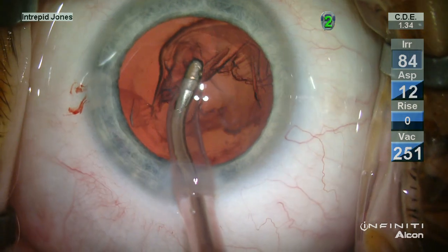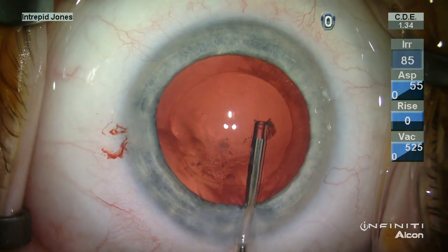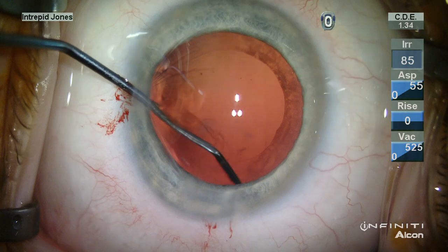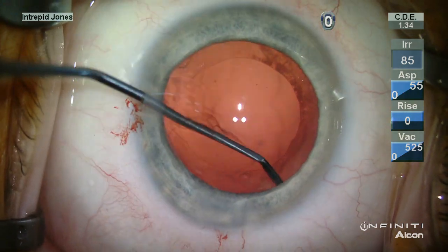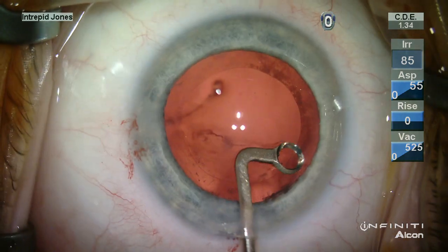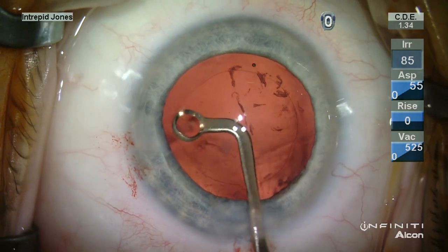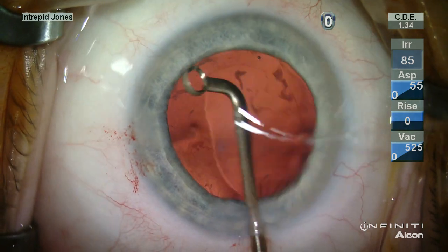In this case I'm going to polish the posterior capsule circumferentially at the area just behind the anterior capsulotomy, and then with a moderate amount of viscoelastic I will polish the LECs and cortical material that remains from the anterior capsular membrane, initially using a Singer sweep from Epsilon followed by a ranch curette from Geuder. This allows me, using these two instruments, to reach 360 degrees of the capsular membrane through standard incisions.